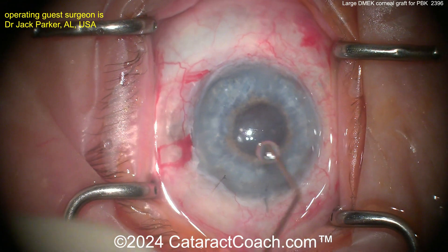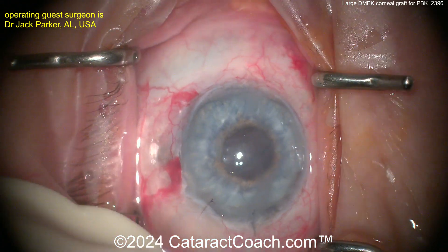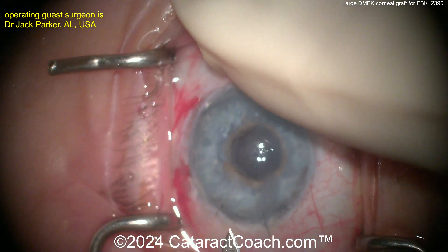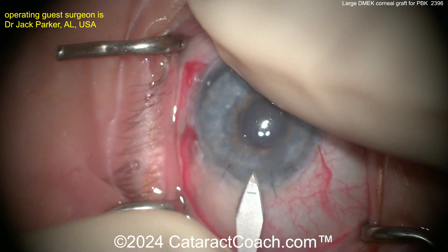Dr. Parker does a lot of these in his office-based surgery center, and does these with just topical anesthesia and oral valium. Patients don't even have an IV in.